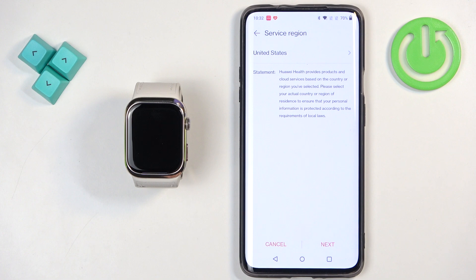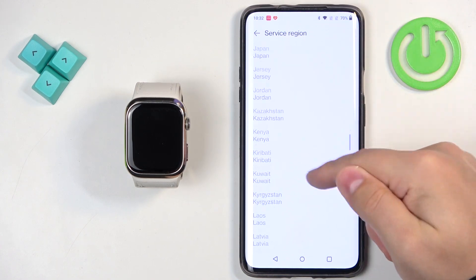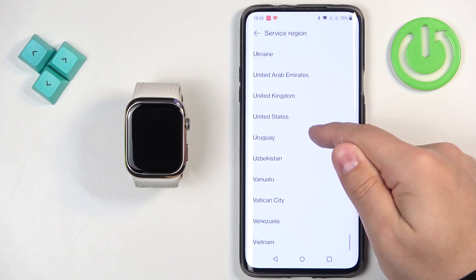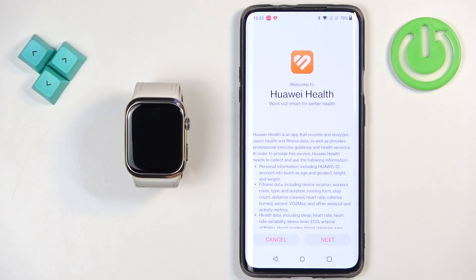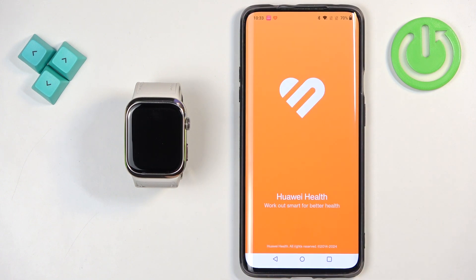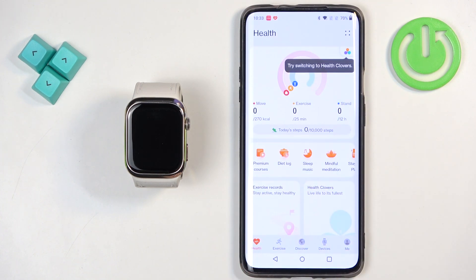After you open the app, you will probably see the service region page. We need to select the region — tap on the field, scroll through the list, and find the region you would like to use. Once you find it, tap on it to select it, then tap on next. Tap next again, agree, and allow ordinary permission for physical activity. Once you're done, you should see the health page in the app.